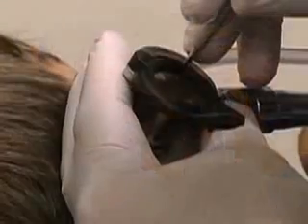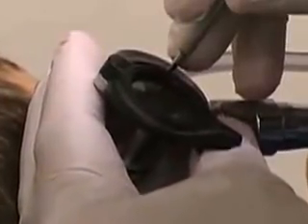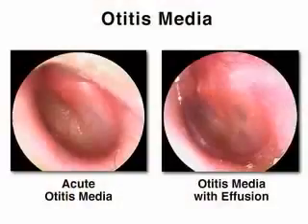Pneumatic otoscopy and cerumen removal will be discussed in this video. Mastery of otoscopic examination techniques is necessary for the accurate diagnosis of otitis media. Otitis media is a general term for middle ear inflammation and may be classified clinically as either acute otitis media or otitis media with effusion.